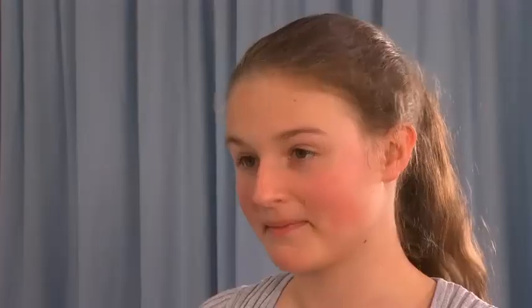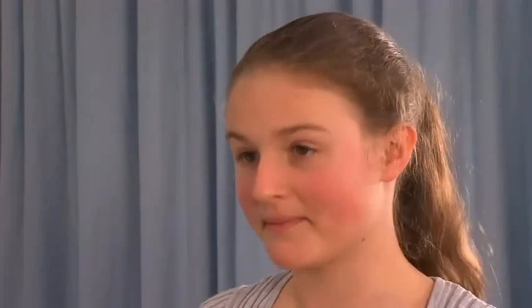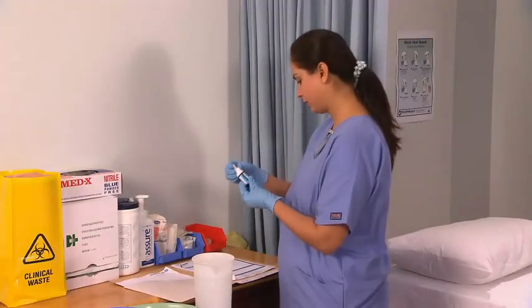Confirm the patient's details. Explain the procedure to the patient. Enquire about any known allergies. Obtain verbal consent to proceed. Then perform a second medication check.